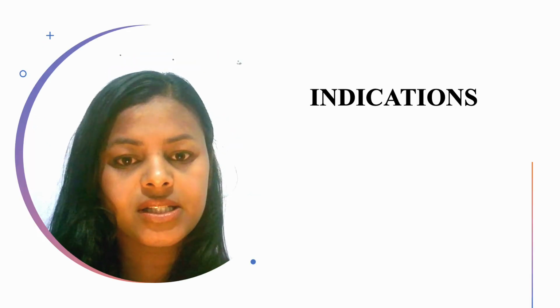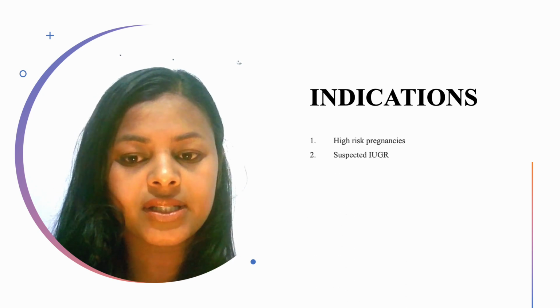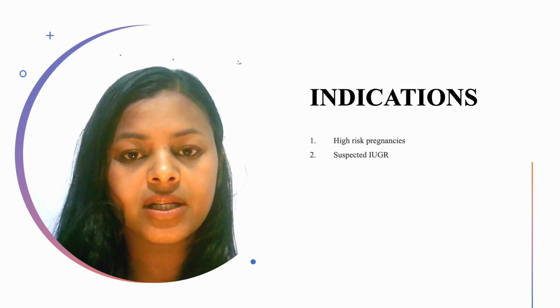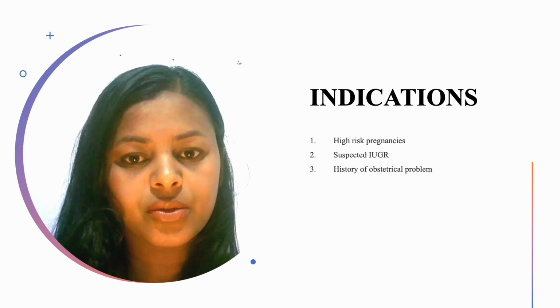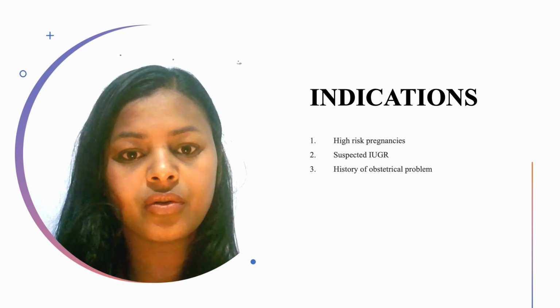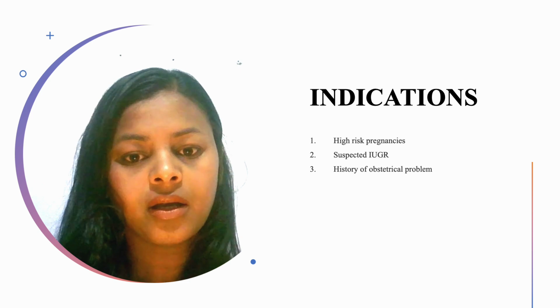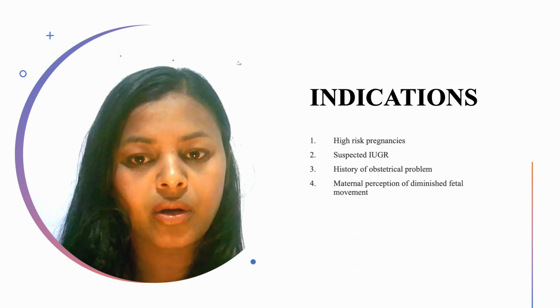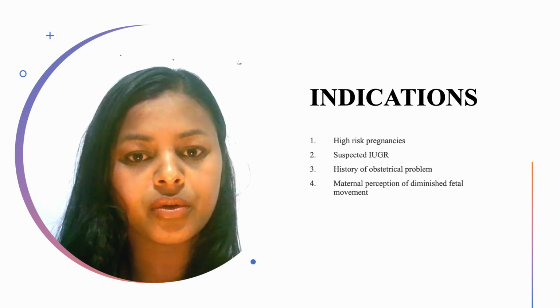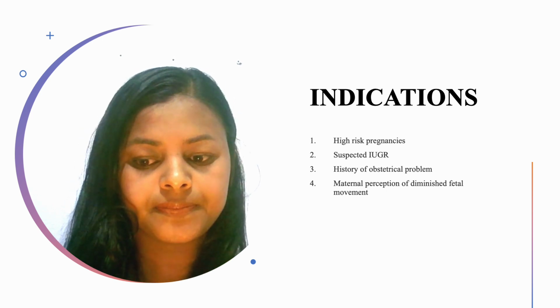We also do the CTG if intrauterine growth retardation is suspected, where the baby inside the uterus has not grown properly. CTG is also done if the woman has a history of obstetrical problems such as miscarriage, preeclampsia, bleeding, etc. CTG is also done if the pregnant woman complains of or comes to the hospital with less or no perception of fetal movement.